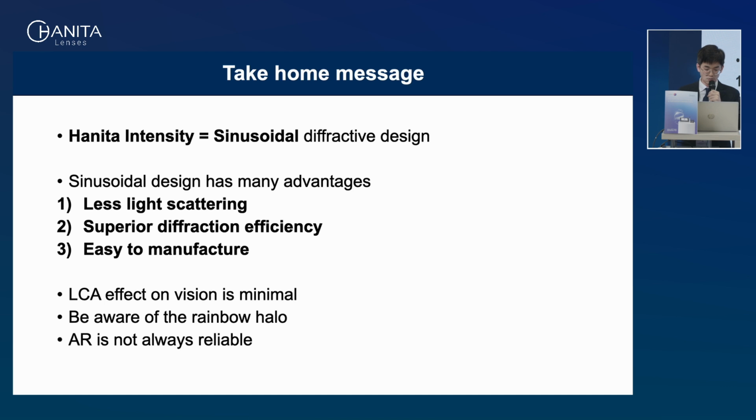So here is the take-home message. Intensity is a very unique design, an interesting sinusoidal diffractive design, and this design has many advantages such as less light scatter, superior diffraction efficiency, and easier manufacturability. So please keep in mind there should be an LCA effect, which is pretty minor, but also your AR result is not always reliable. Thank you for listening.